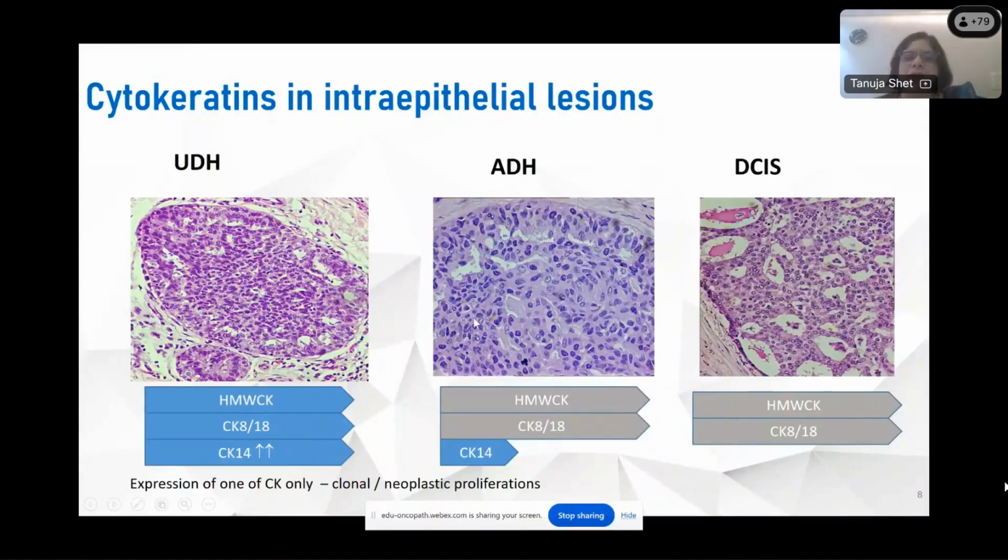In atypical ductal hyperplasia, I start seeing atypia in the nuclei, and this little haphazard proliferation now becomes organized. The word organization means polarization of cells. You can see in the right side image that the cells start to orient around the lumen. That's polarization in intraductal hyperplasias.